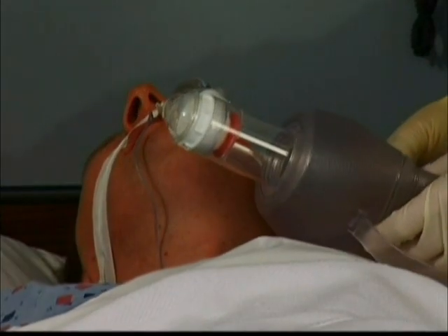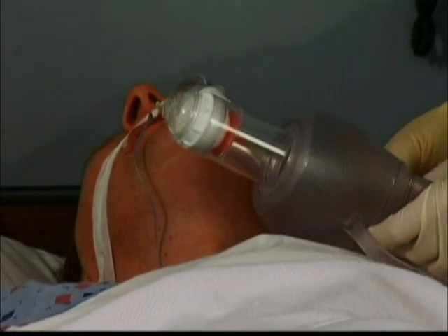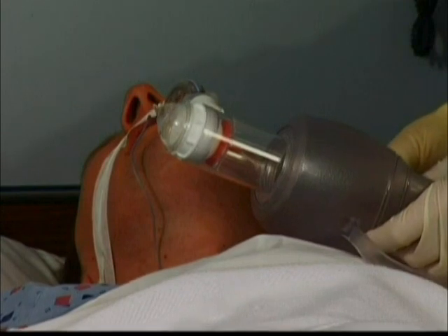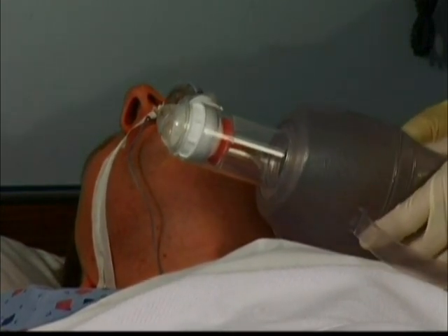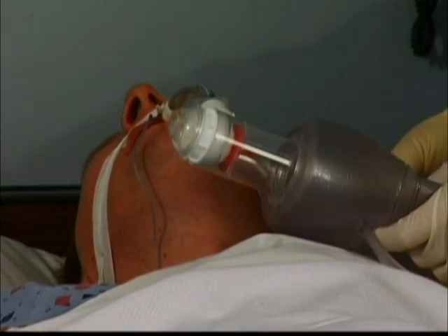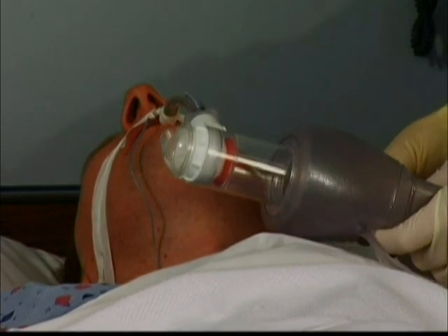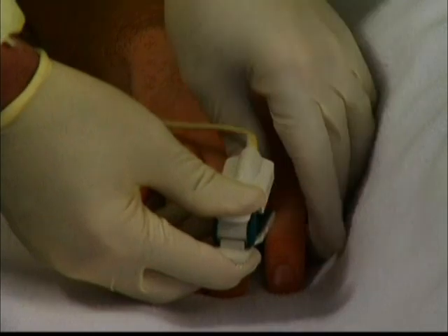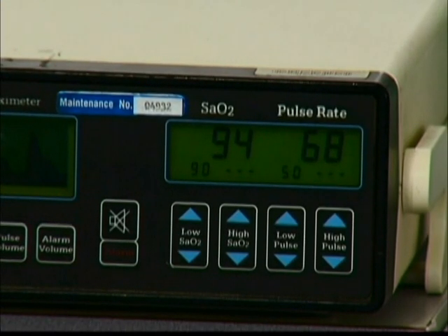The volume and pressure delivered to actual patients will vary based on the patient's condition. To help determine adequate ventilation, you should observe the patient's chest rise with each squeeze of the bag. You must also provide adequate time to allow for exhalation. Heart rate varying significantly from pre-bagging levels suggests insufficient or ineffective manual ventilation. The patient's color should remain normal or pinkish, indicating adequate oxygenation. Pulse oximetry may be used to monitor the patient during bagging, and a pulse oximeter reading should be maintained at or greater than 90% throughout the procedure.